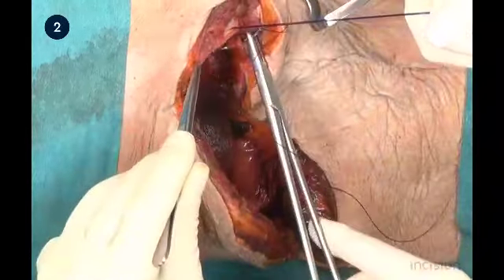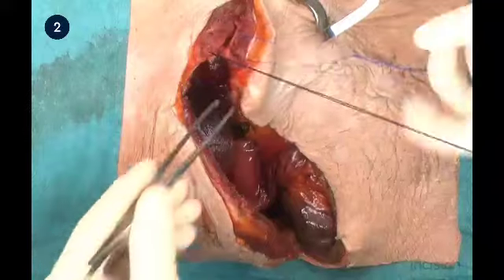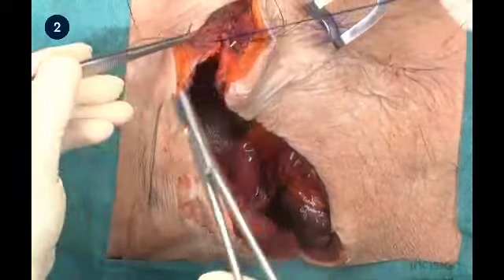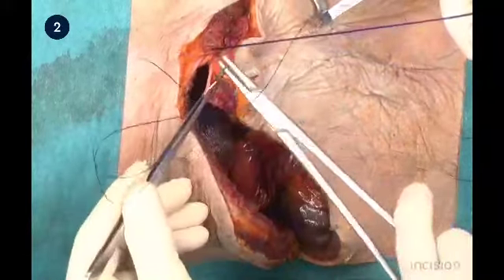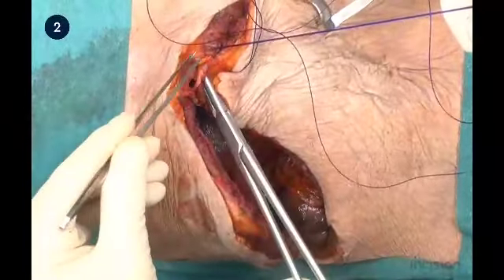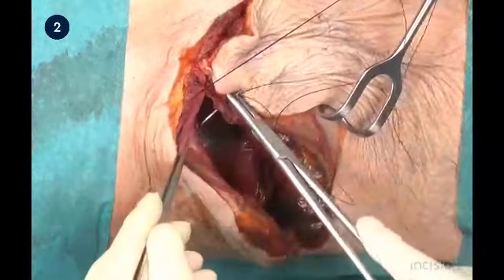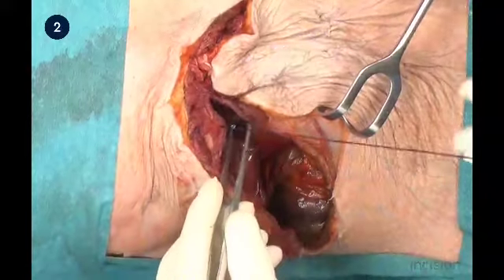The abdominal wall closure is now shown for the Kocher's incision. Because the incision was extended in this patient, the abdominal wall is closed in a medial to lateral direction. If a true Kocher's incision is used, it is advised to close in a lateral to medial direction to facilitate optimal view of the lateral corner. The posterior rectus sheath is closed using a continuous absorbable suture with intervals of approximately 1 centimeter.